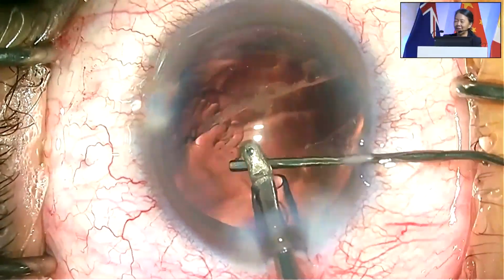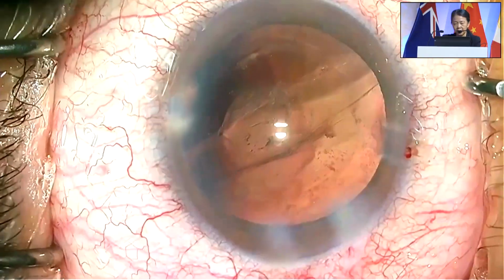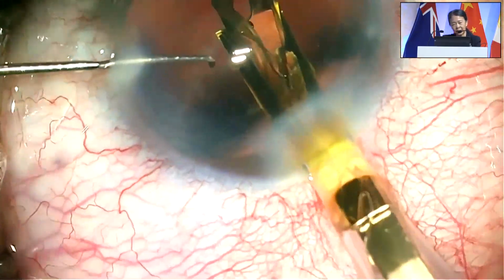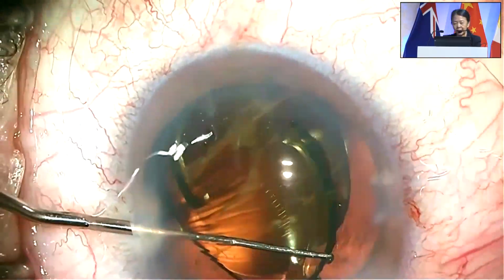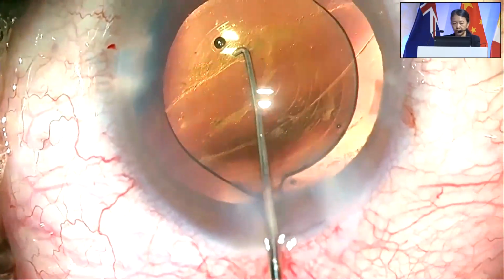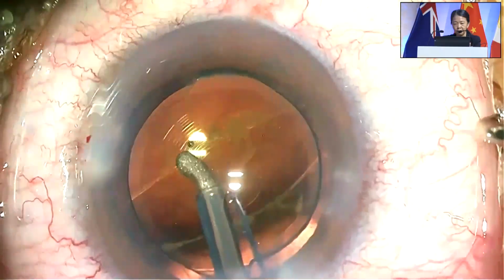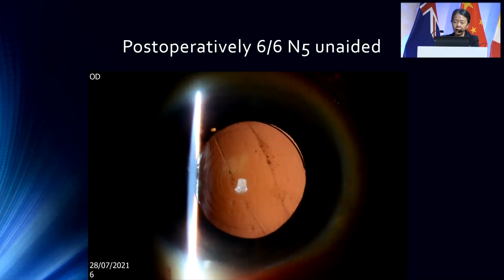Okay, this is the fun part. So I thought, okay, I'll try and grant you your wish. This is your dominant eye. You want this in, all right. I would have preferred this to be the non-dominant eye. But because there's no loss of capsule, the support is still there, I can do it very simply. And so he had a good outcome for this eye.